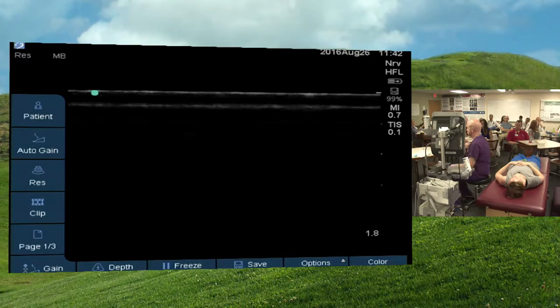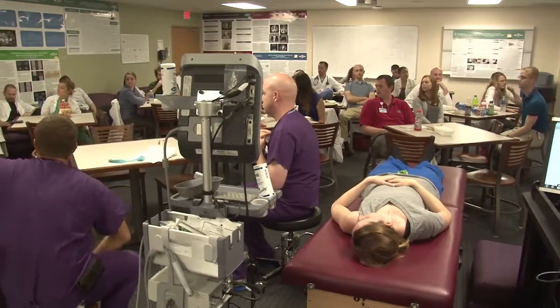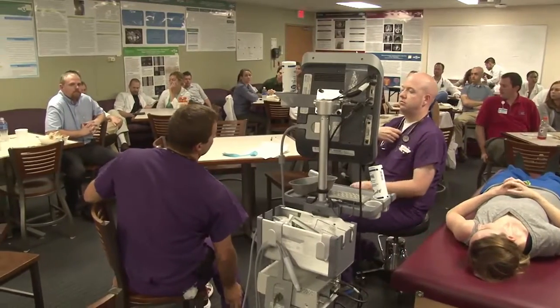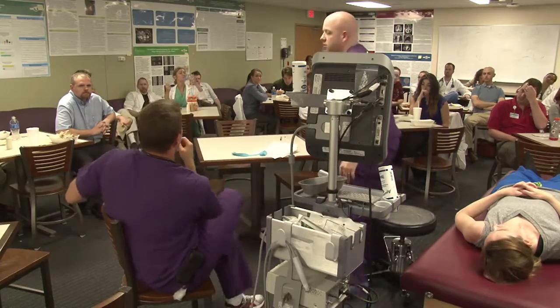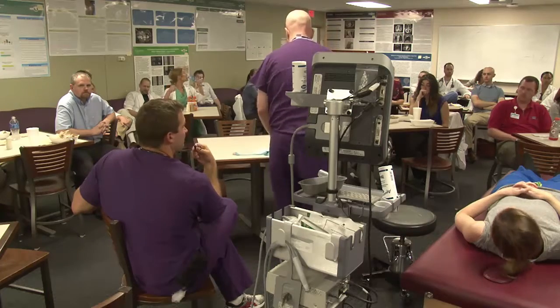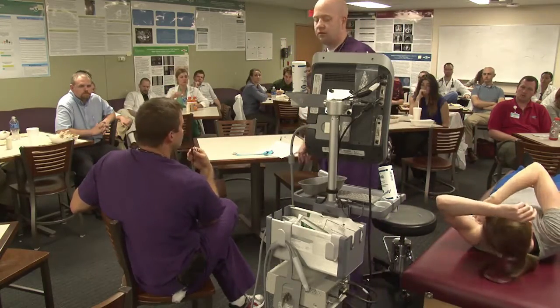Did you ever used to do the nerve blocks just by palpation? Yes, absolutely. So the question is, did we ever do nerve blocks without an ultrasound? And the answer is absolutely yes. All of the anesthesia books describe how to do them without ultrasound.